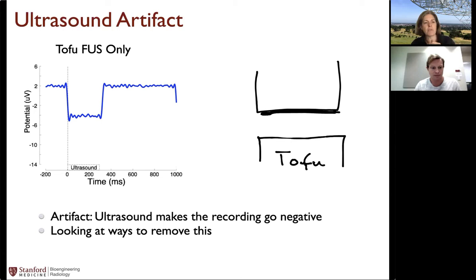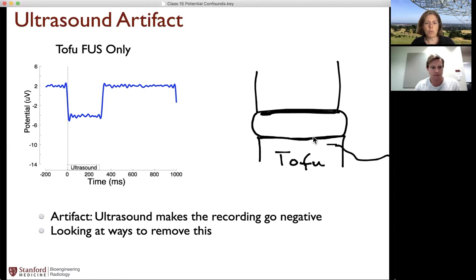And this is the data that we got from the ultrasound only, not in the sheep, but in a tofu phantom. It looks like this, where we have the transducer up here. We've got our tofu. This is the water membrane that's coupling the transducer into the tofu. And then this is the electrode in the tofu. What we were seeing is that when we put the ultrasound on, it's 300 milliseconds on, there was a measurement in the electrode that looked like this. This was about the size of what we were measuring with the visual evoked potential. So definitely a bit of a messy problem to have this overlapping on top of the signal.